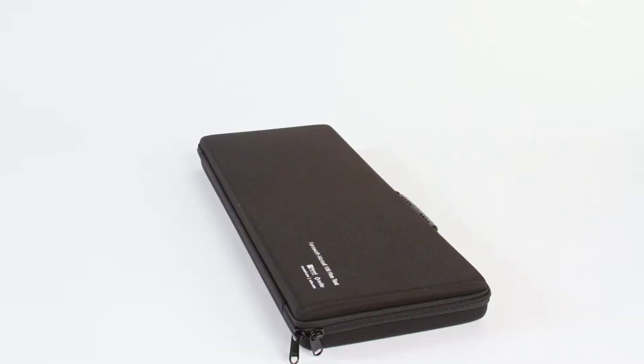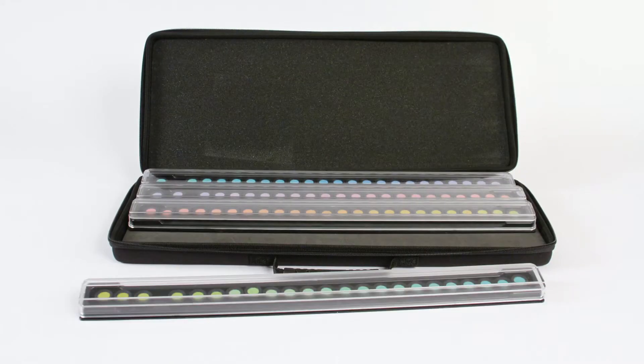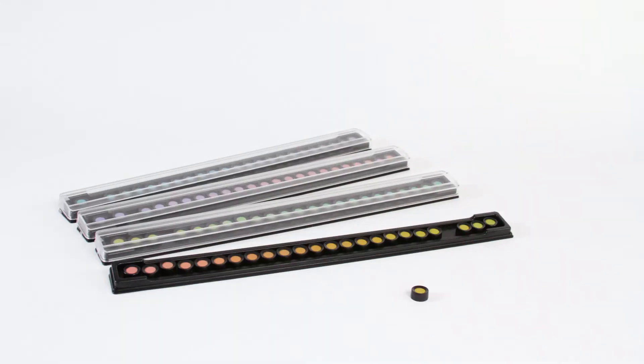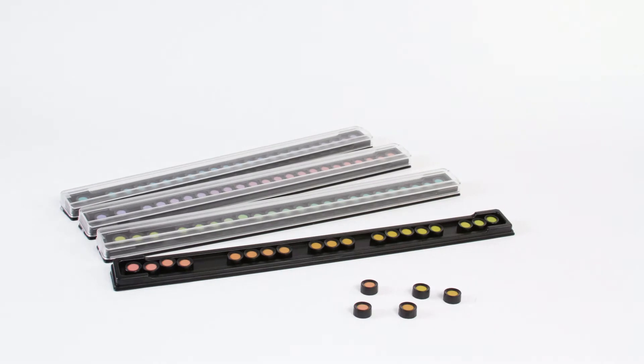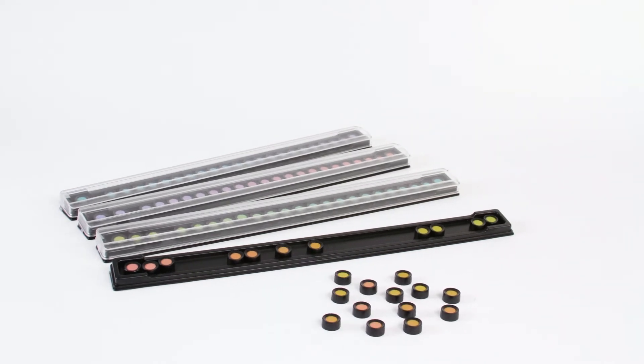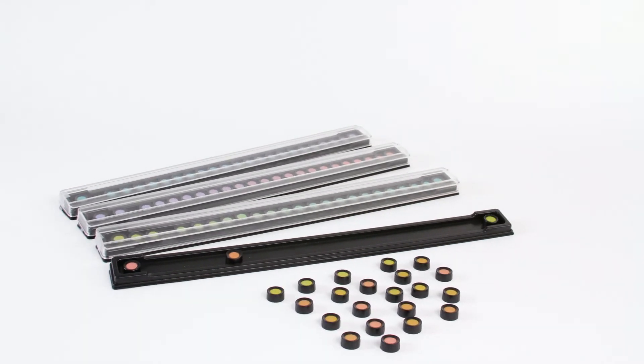The FM100 Hue Test consists of 4 trays containing 85 removable color reference caps and incremental hue variations spanning the visible spectrum.